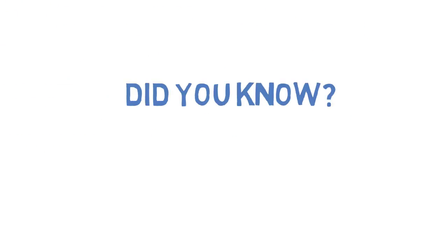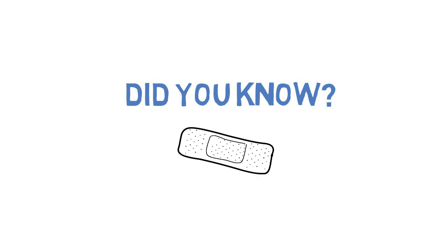Did you know that catheters have been around since 3000 BC and have been made out of many different types of materials over the years, including hollowed out bamboo straws, rolled up palm leaves, the hollow top of onions, as well as a variety of different materials such as gold, silver, copper, brass, and lead. Now talk about some uncomfortable catheters.